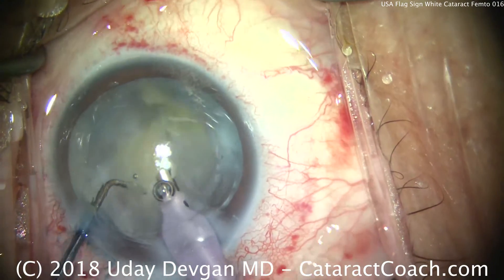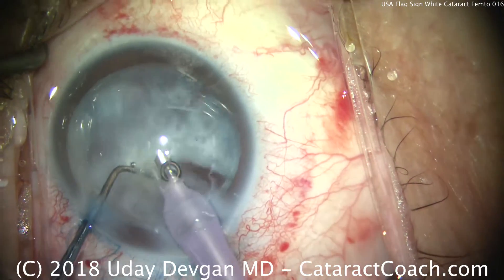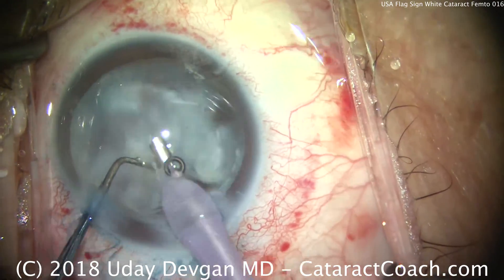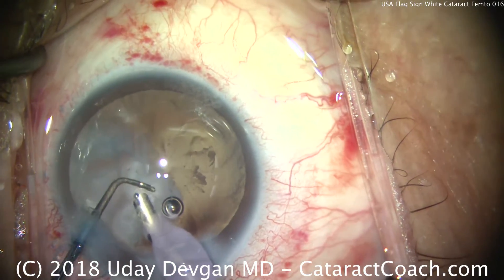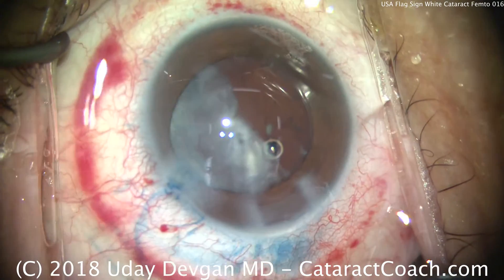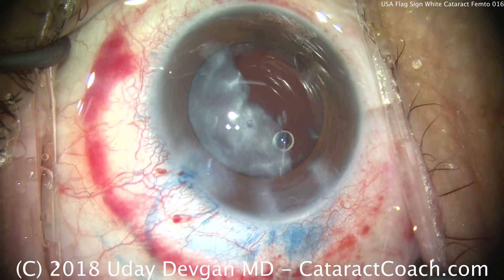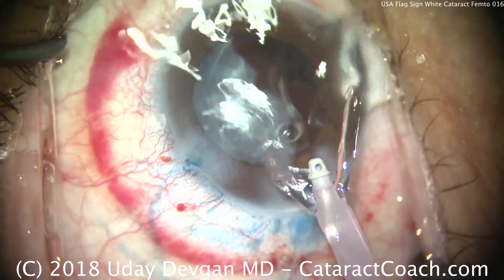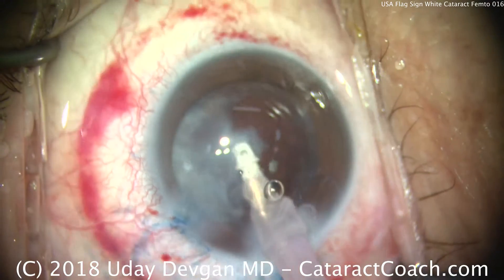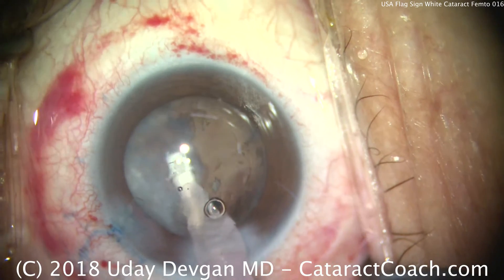Chopper being placed in the same position as these last few fragments come out. There comes most of the epinucleus as well, and you can see there's very little cortex left in the capsule bag. Now, I still make my incisions with the diamond keratome — I think they do create a nicer incision than the femtosecond laser, at least for now. That may change in the future.